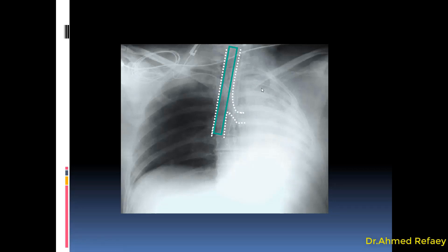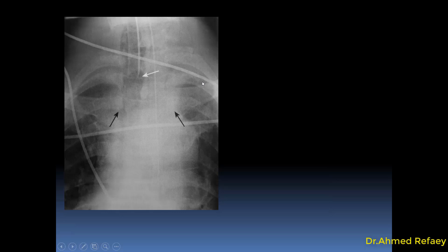This is another example of proximal malpositioning of the endotracheal tube. As you can see, the tip is above the level of the medial end of the clavicles, creating the risk of damage to the vocal cords.